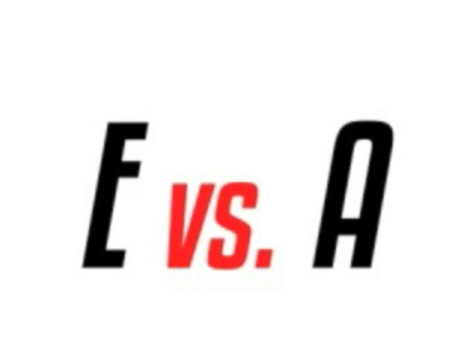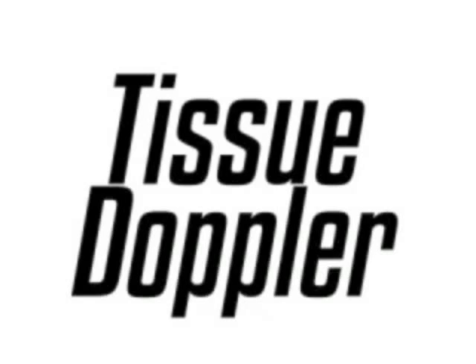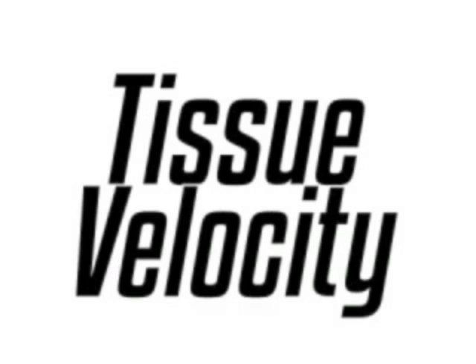So to differentiate those two, we do what's called tissue Doppler. Instead of looking at the velocity of the flow of the red blood cells, we're going to look at the velocity of the actual tissue. And then, for a normal pattern, you're going to get E prime greater than A prime, and the pseudonormal pattern is going to be A prime greater than E prime. So that's how we're going to differentiate normal and pseudonormal filling. And now remember, if you just did the tissue Doppler and the E prime is greater than 8 and greater than A prime, then you're done. That's normal diastolic function.